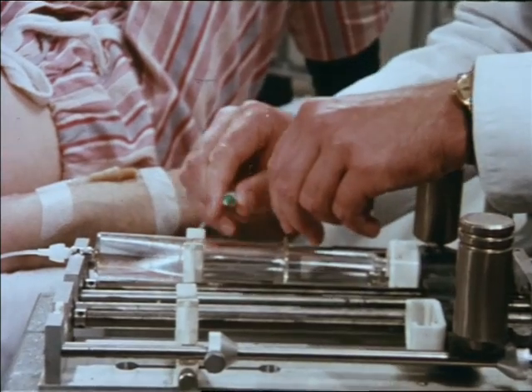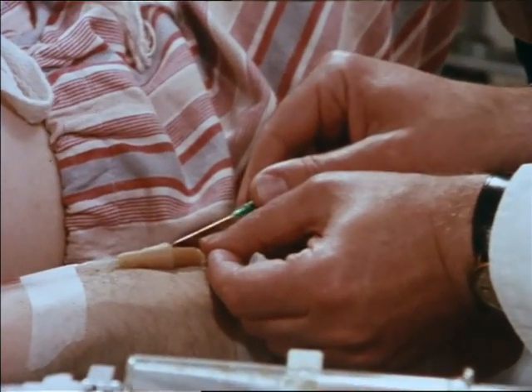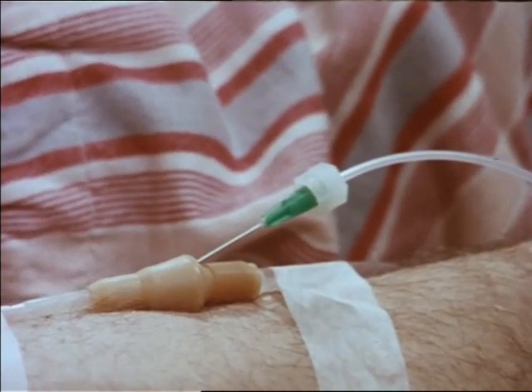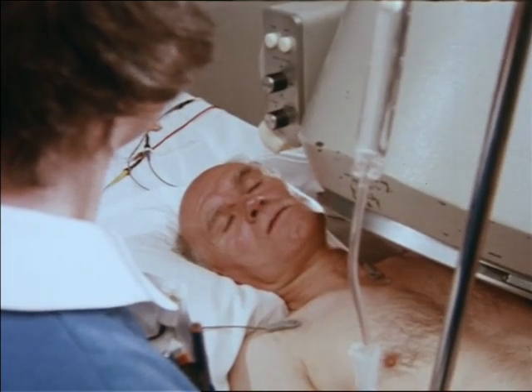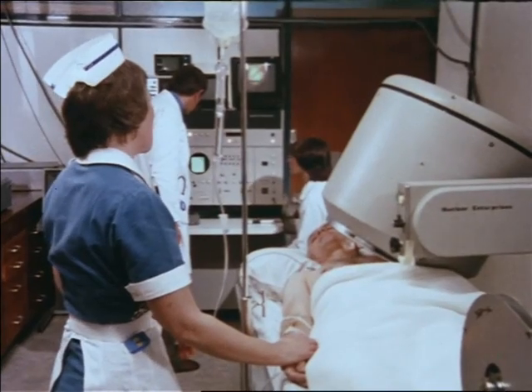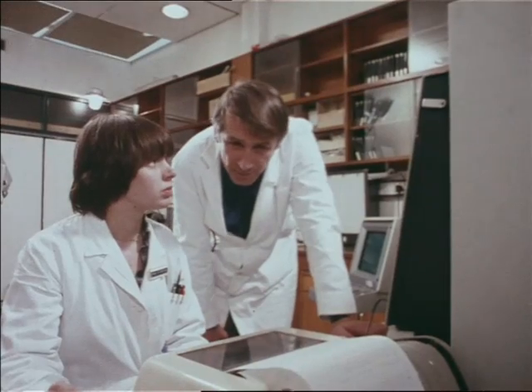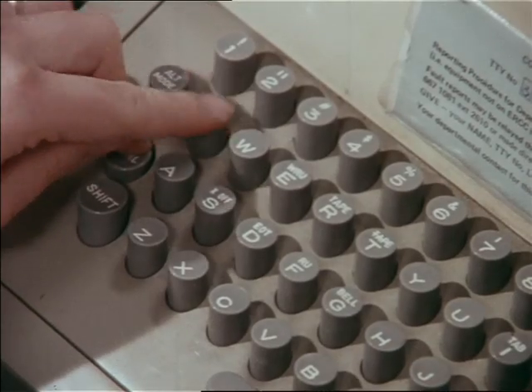You won't feel a thing at all. You'll hear us talking and you'll hear the machines chattering, but don't worry about it at all. So they try a drug which could help the heart to work more efficiently, and the effect can be seen. Within a few minutes, the yellow patch almost disappears on each heartbeat. It means that once again, the heart is working well. You're feeling quite comfortable. The patient has been lying here chatting to the nurse for a little over an hour, but in that time his heart has been observed at rest, during exercise, and under therapy. That's the best bit. While this new technique teaches doctors more about this most vital organ, it's also improving treatment.